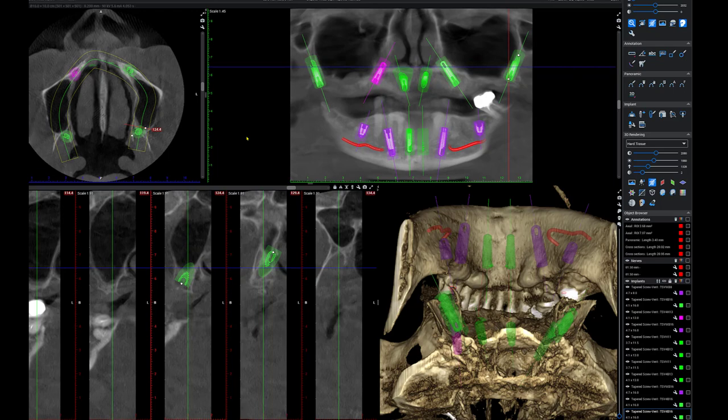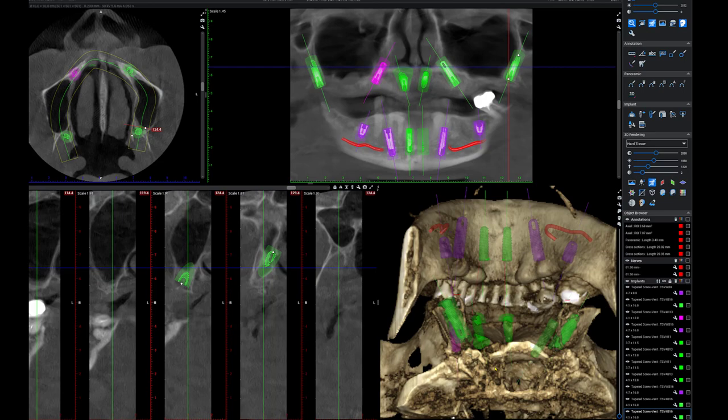I'm pretty happy with what I have there on both sides. Now we're going to look at this from the 3D reconstruction.